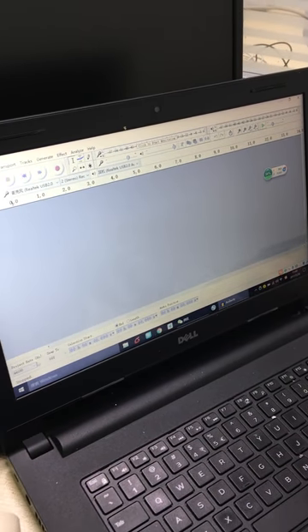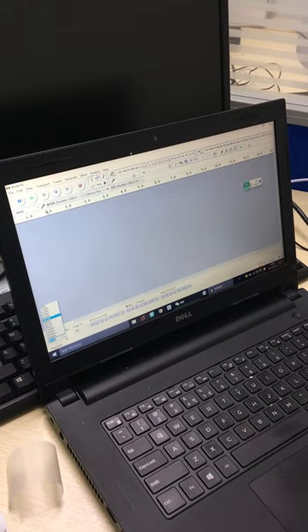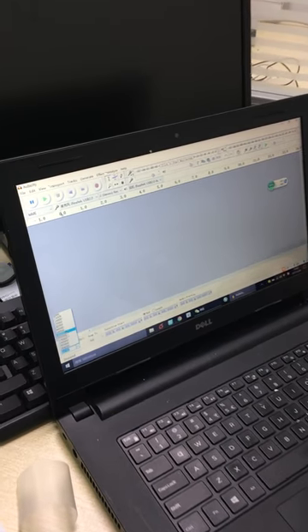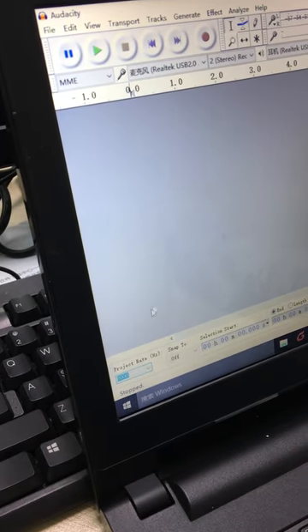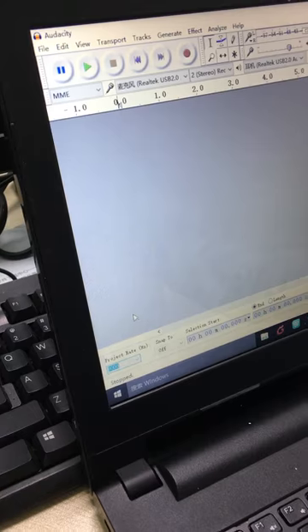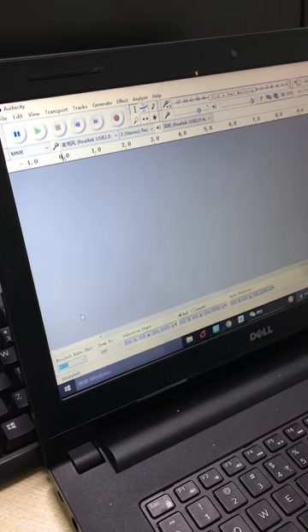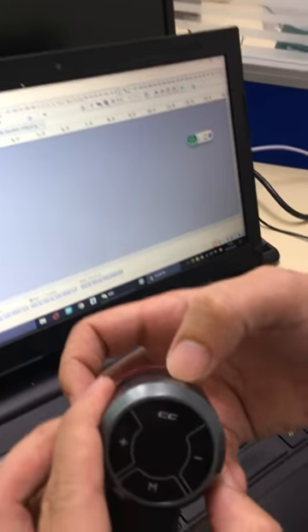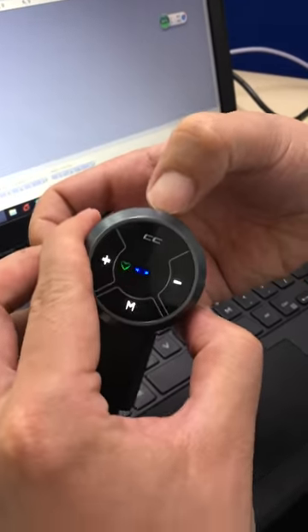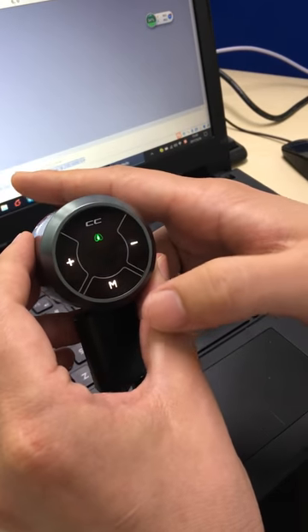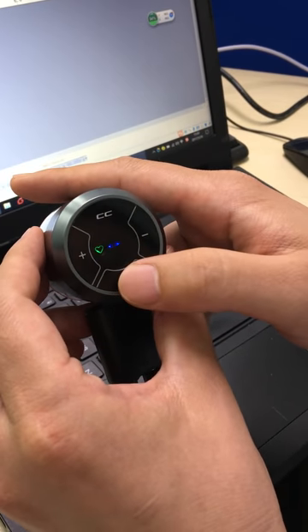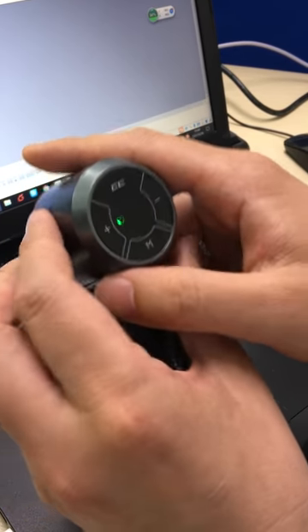Also, you can change the sample rate. Then, open the stethoscope. Select the mode. We put the heart mode.